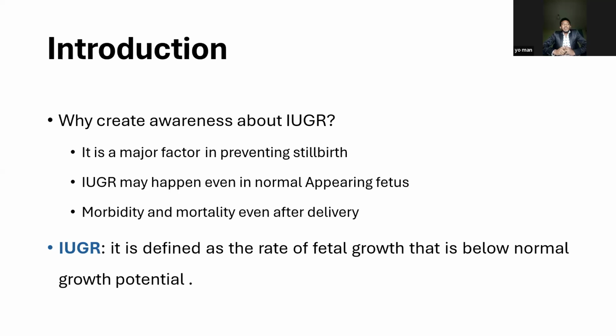Okay, so if there is a masking of FGR with that normal looking fetus, and it is delivered normally, that fetus may develop consequential neurological and other problems even after delivery. So the most important thing is to discuss FGR diagnosis in the prenatal period by ultrasound.